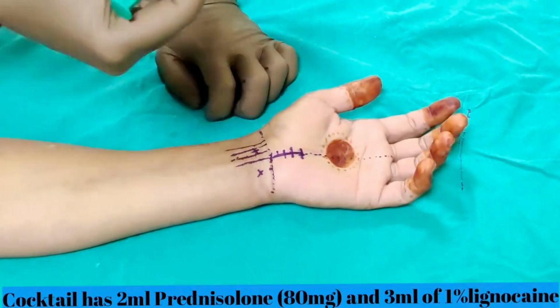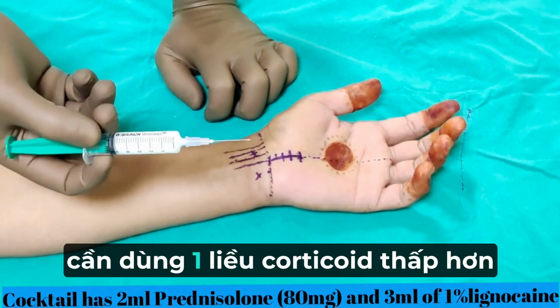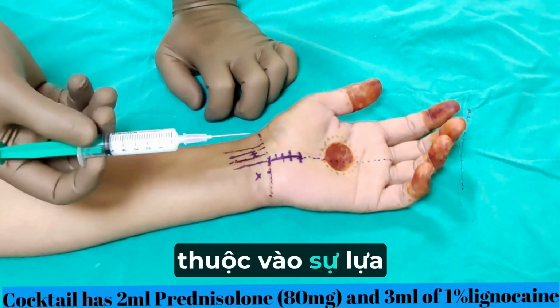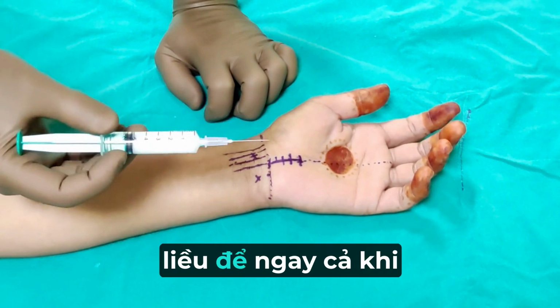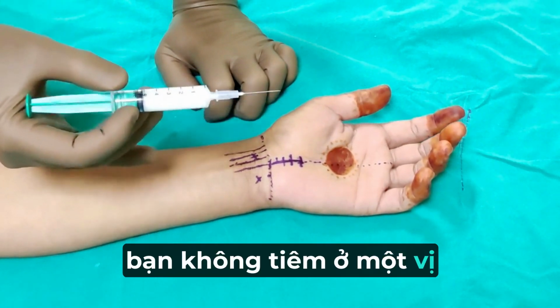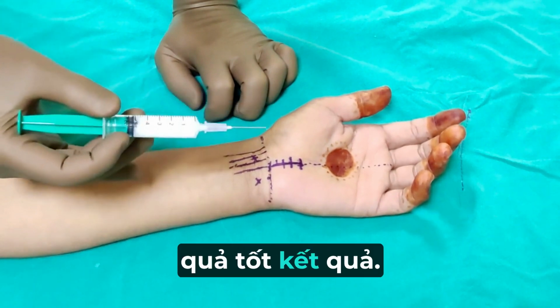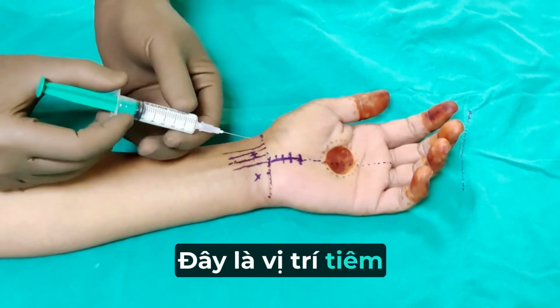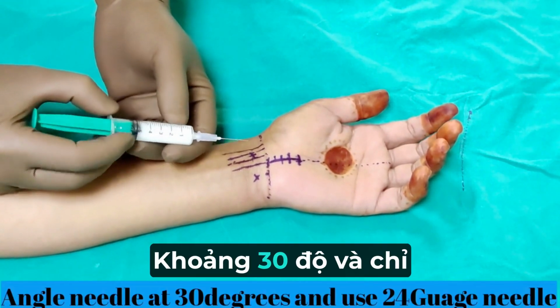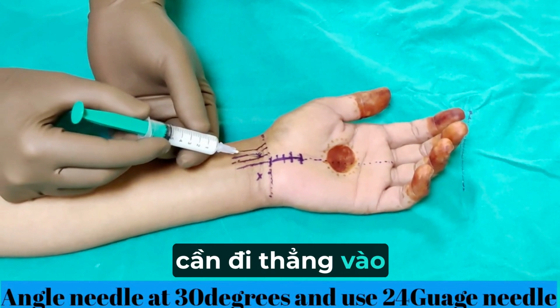A cocktail, if you are doing an ultrasound guided injection, you can just give steroid 1 or 2 ml depending upon your choice. When I do it blind, I always increase the volume so that even if you are not at a perfect position, it will spread and you will get good results. So I'm ready. This is my site of the injection, roughly 30 degrees, and just go straight in.